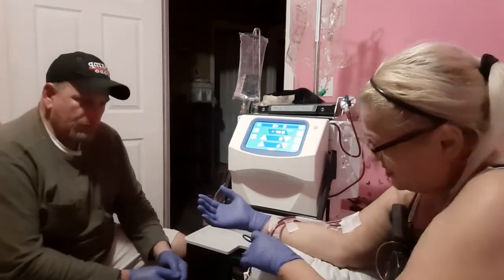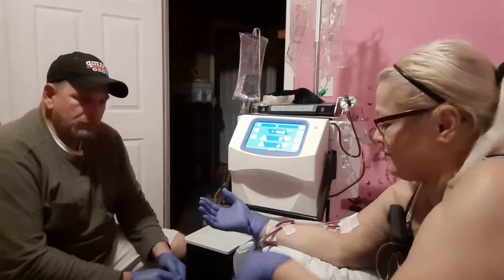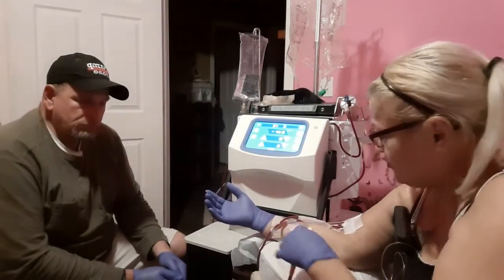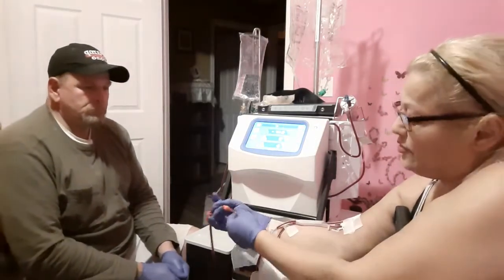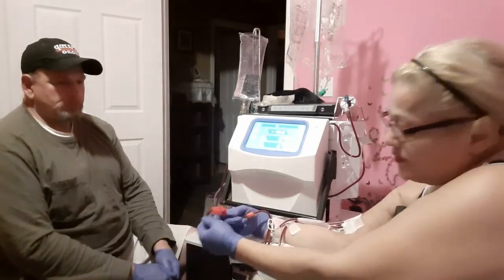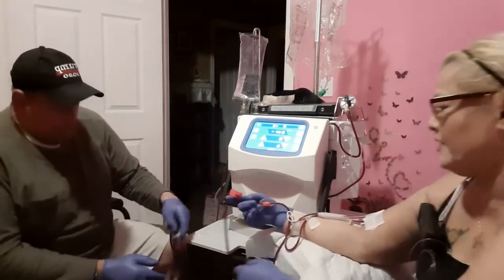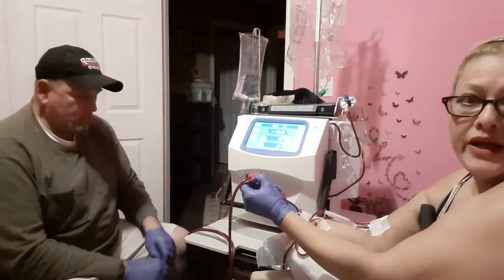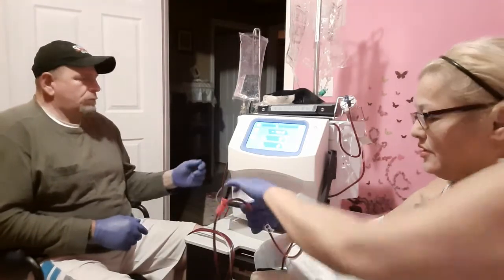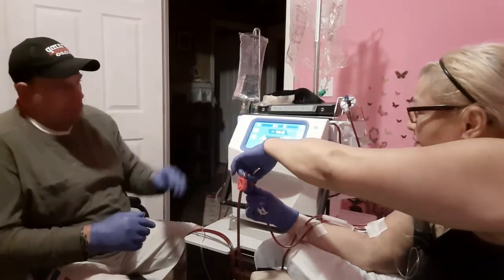clamp. Let me get this off of here. Okay. So I need to go to my arterial line, which is the red. Okay. I need to clamp, right clamp. Are you on my line? It might be underneath the, okay, yeah, thank you. And clamp the red, okay? And we're going to disconnect. Go ahead and hit the, yeah.